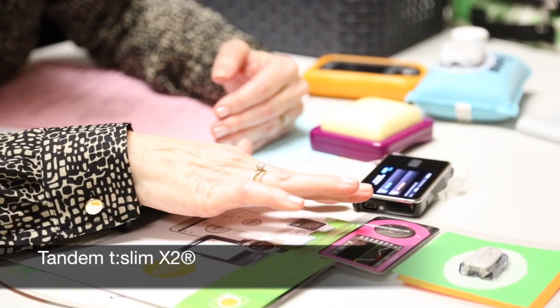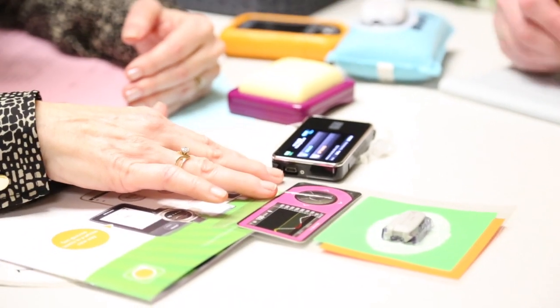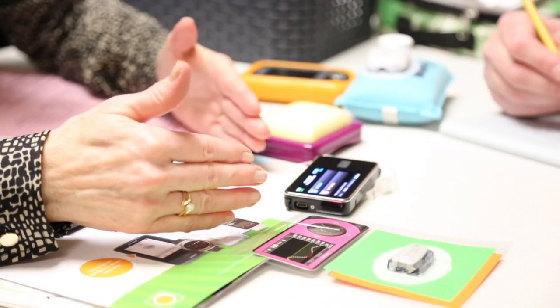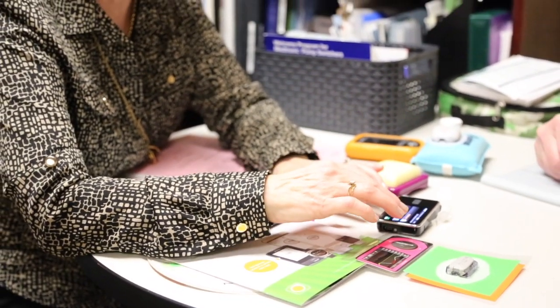The Tandem also is working on the next steps of an integrated system, so that using this information, it can affect the basal rate and bolus doses. So it's kind of moving into even more technology. Yes. It's not an artificial pancreas, but it's moving in that direction. It's moving to integration on that.